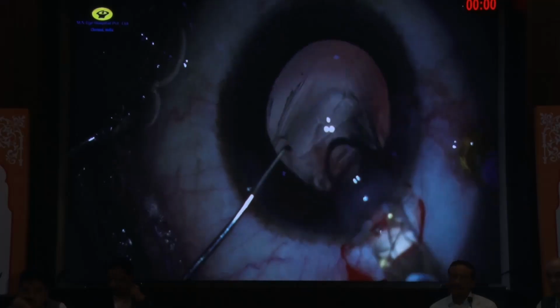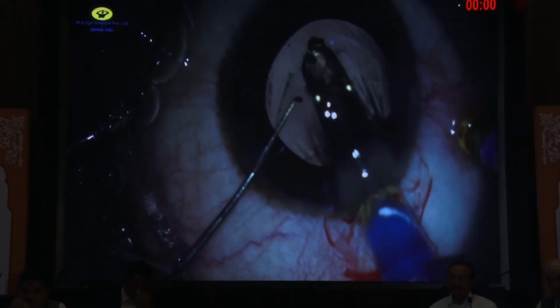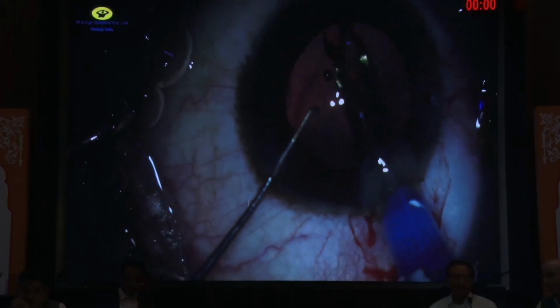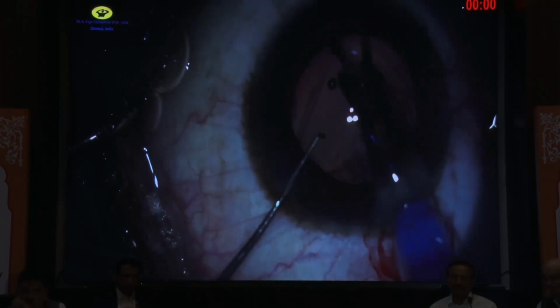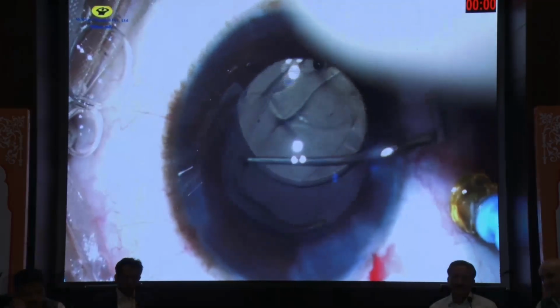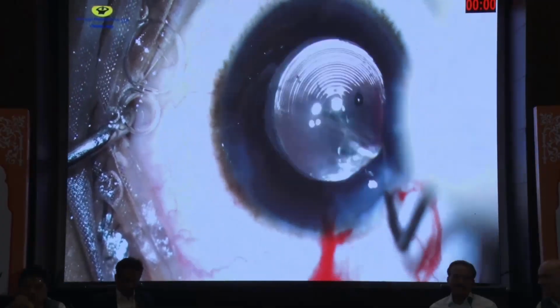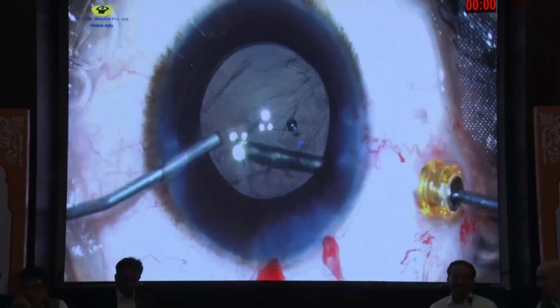See, in this particular case, because it was multifocal, what we could do is save the posterior capsular margin, so we could see the extent. I didn't have a 3-piece multifocal choice, so I had to place this multifocal lens into the bag. Here again, making sure that the leading haptic goes into the bag, and then slowly nudging, not dialing like I usually do, just nudge it there. And then you see the lens is stable. You can see the Purkinje image.